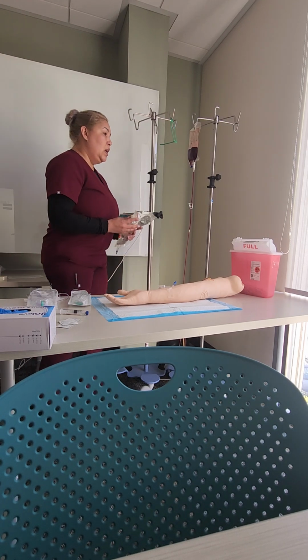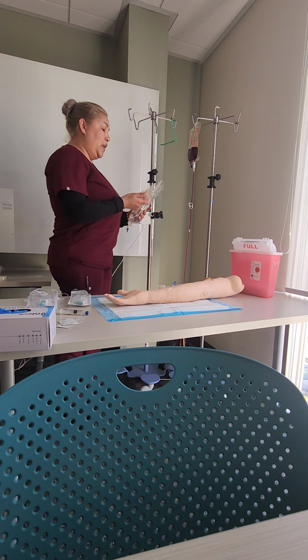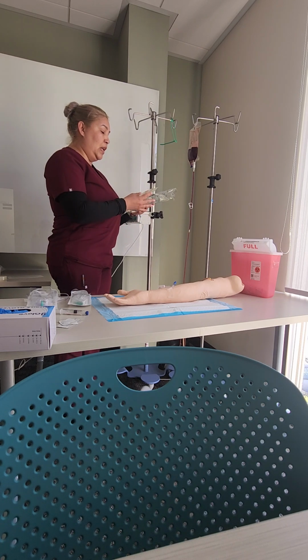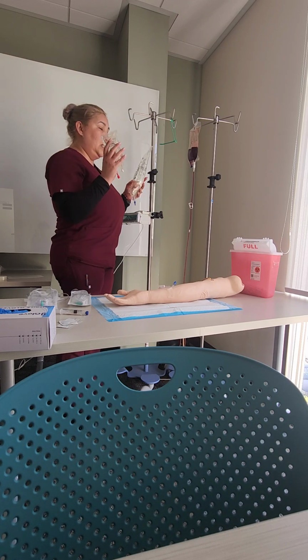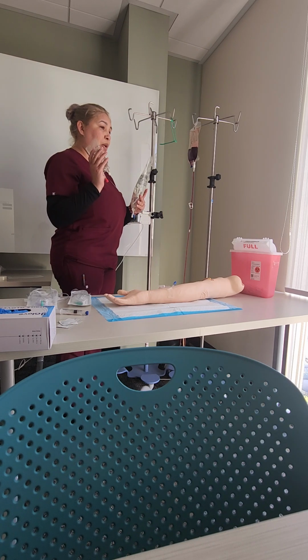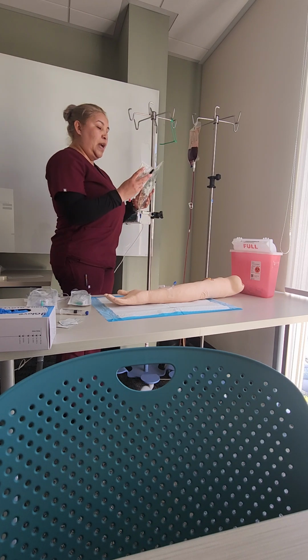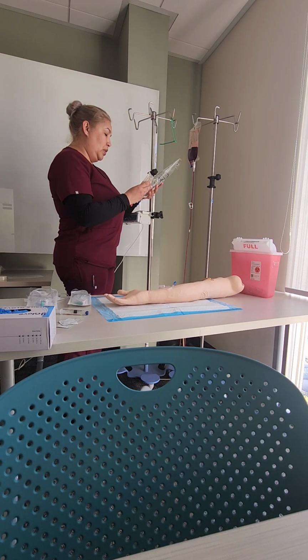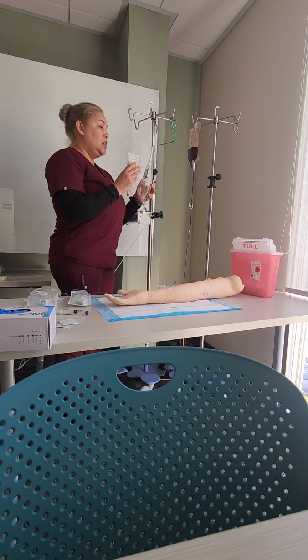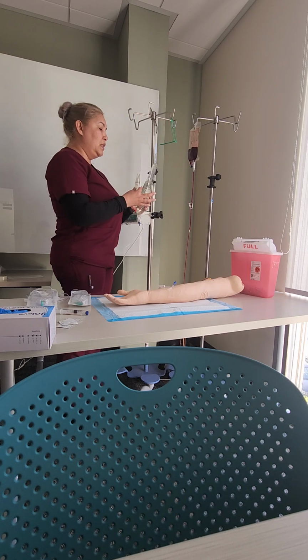What I want to do now is come to the MAR in the patient's room, and do my second check by evaluating my fluids while I have them in my hand, that I still have the right ones that I pulled from the MedCart. I have my solution for hydration. I have my antibiotics. It's the one I pulled. They're both within the dates, so they are not expired.